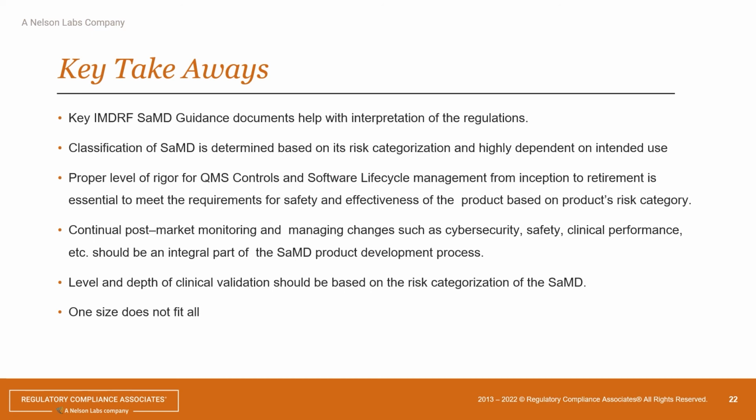Then it's all about, okay, now I put the product out in the marketplace, how do I monitor it? If you're using a DevOps development methodology, it's your ops that keeps track of things coming in, making sure that from cybersecurity and clinical performance you're okay. Typically with software, since it works with other systems, we take some inputs, and some of these might come, for example, from an EHR.